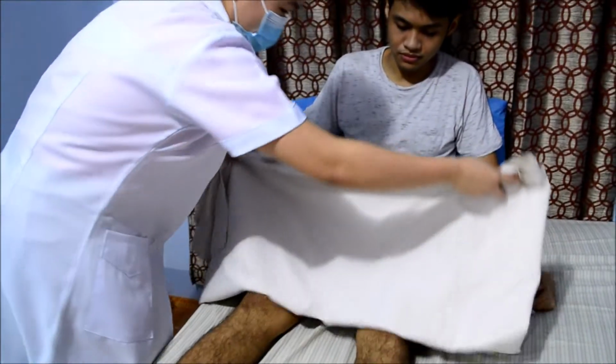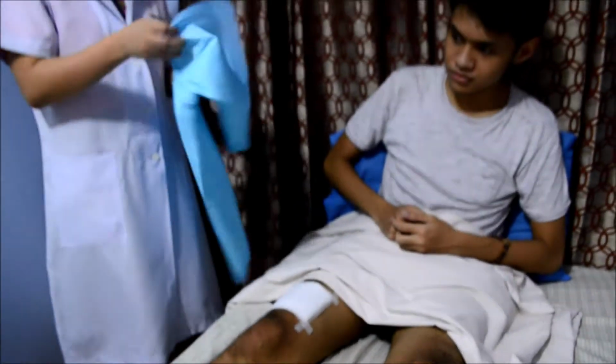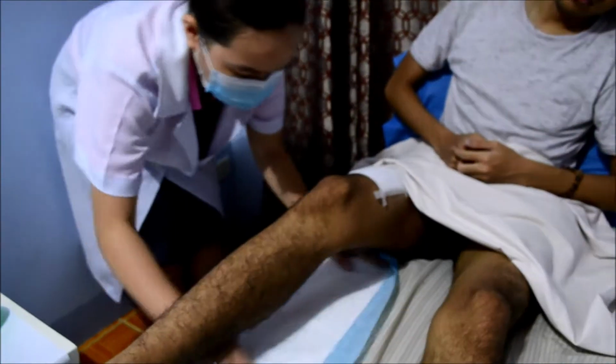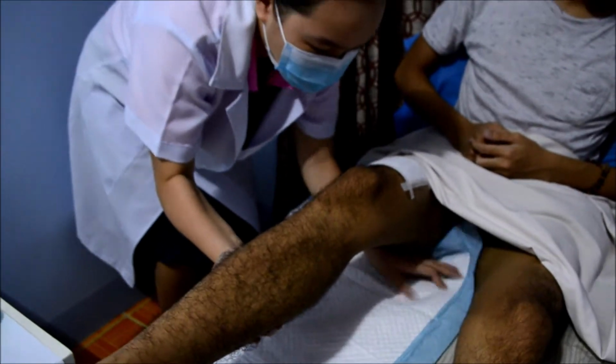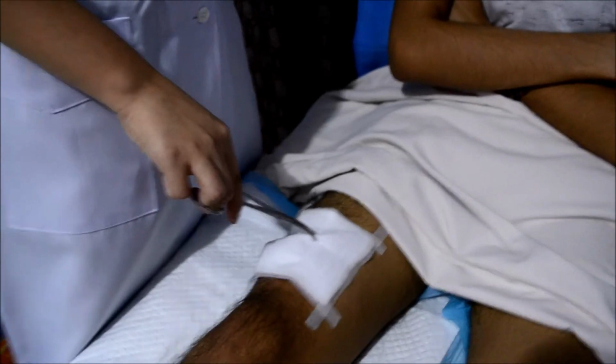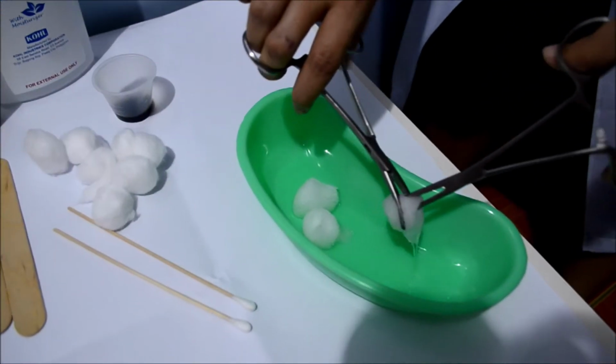So, I will start now, sir, with the removal of your dressing. Open, sir. Okay lang mo sir. Place the curity pad underneath the patient's affected area and drape if necessary. Slowly remove the soiled dressing with the dressing forceps.